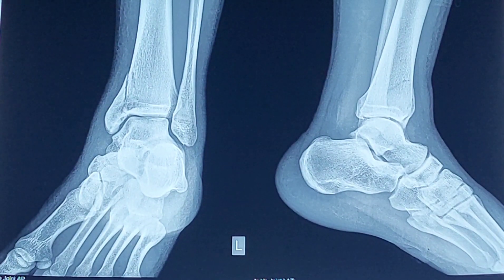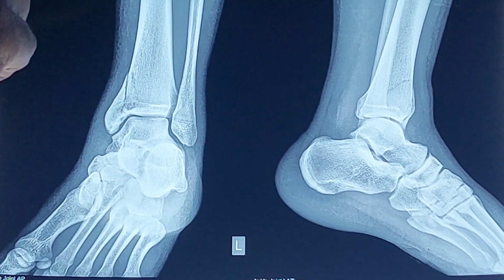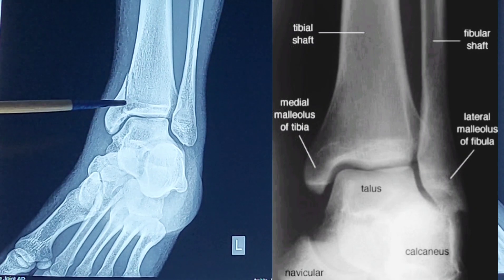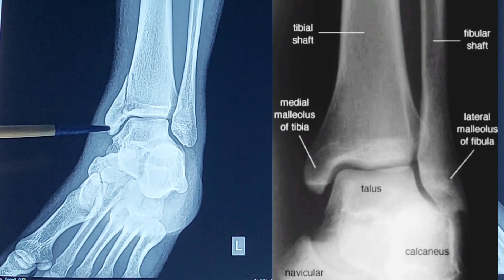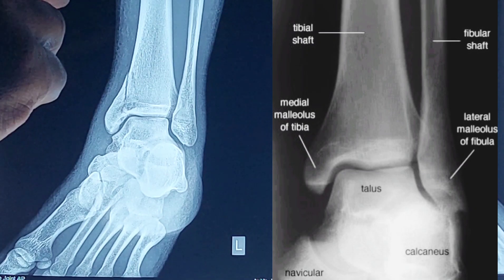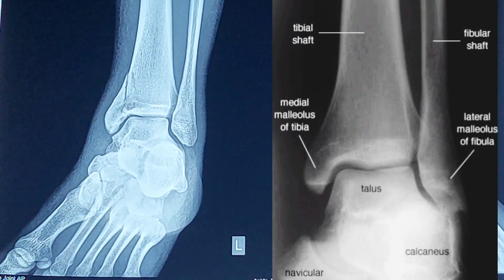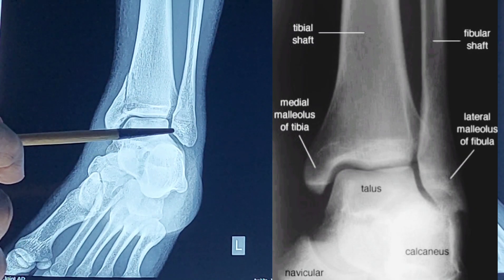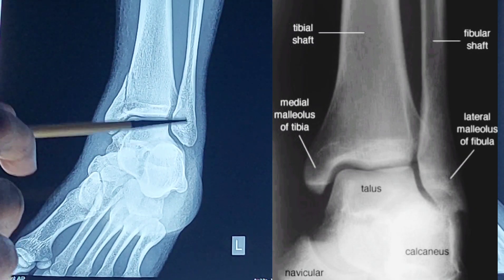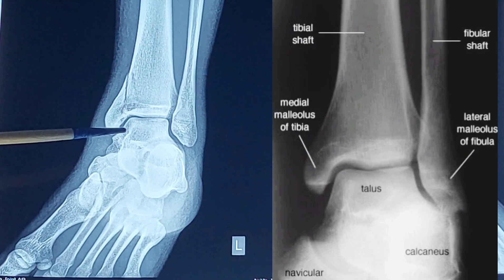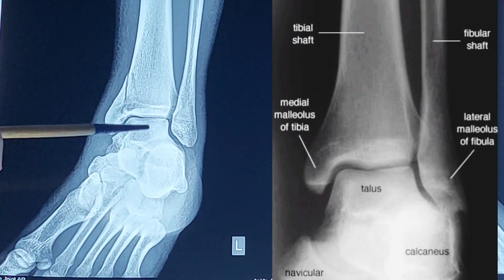What can we see in this X-ray film? Here we can see this is the lower end of the tibia, and this is a projection from the lower end called the medial malleolus. This is the fibula, the lateral bone of the leg, and this projection from the lower end of the fibula is called the lateral malleolus. Here is the body of the talus.